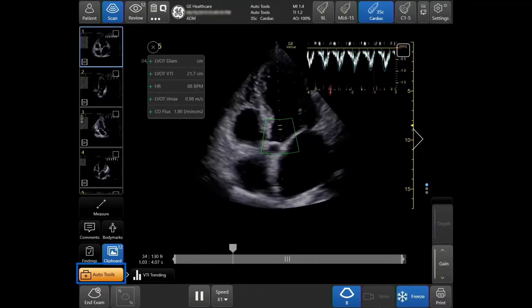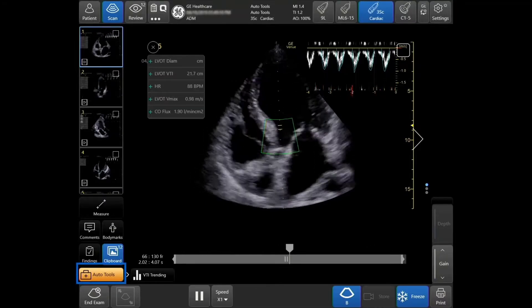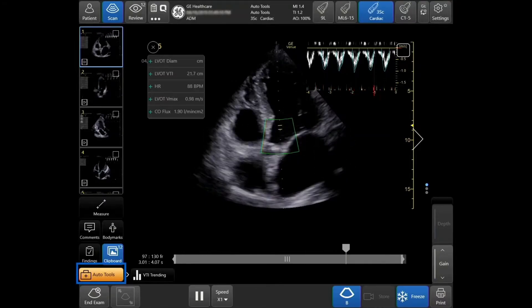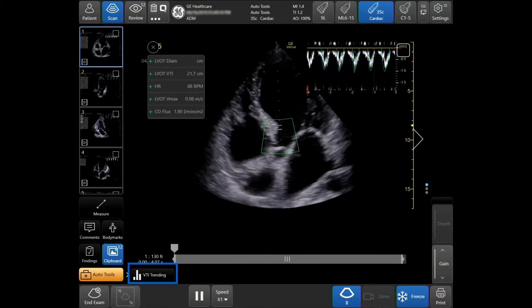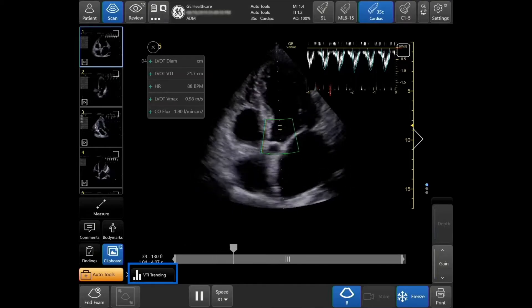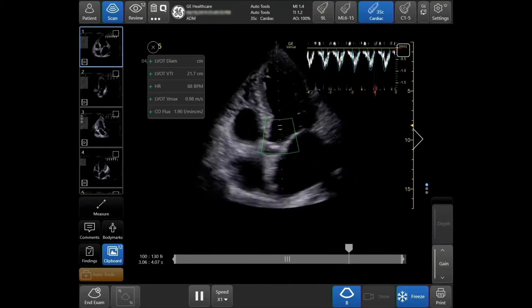Select the Auto VTI tool if you are scanning live, located in the bottom left-hand side of the touch screen.